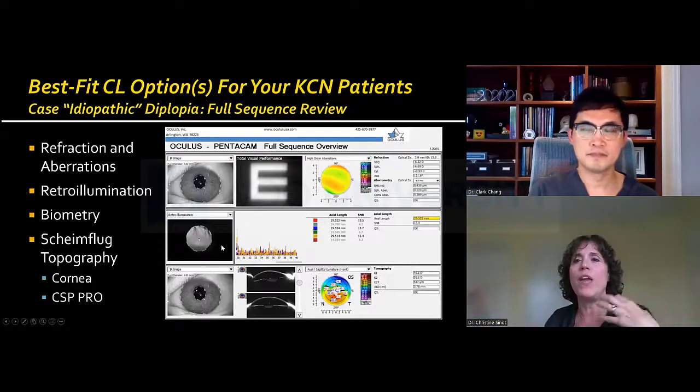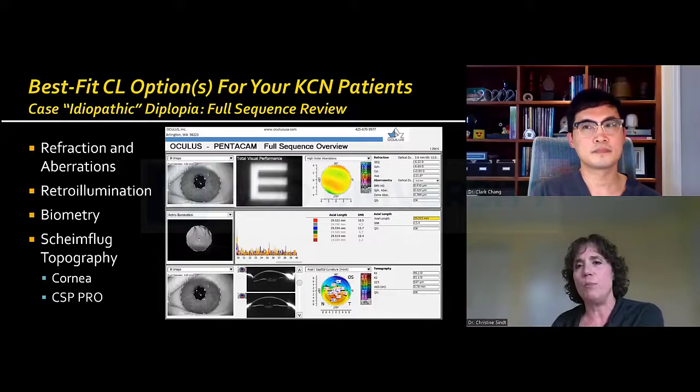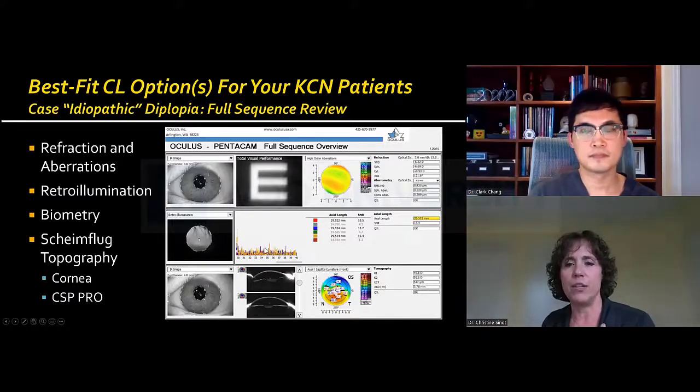I mean, they could have these and see the same between it. So if you're going to look for glasses, or a soft contact lens, use that retro illumination to say, where do I need to target? Do a targeted refraction on these patients. Retinoscopy should not be a dead skill for that particular reason.